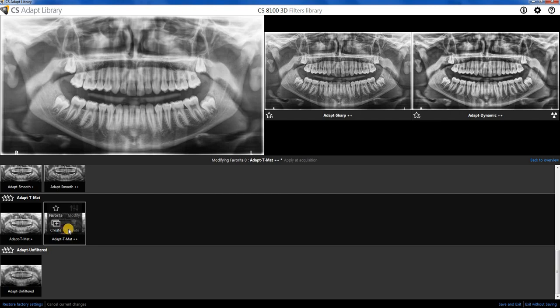If we want to save those in that spot, what we're going to do is click on the favorite button, and then that is saved as favorite in option 0 in the imaging software.